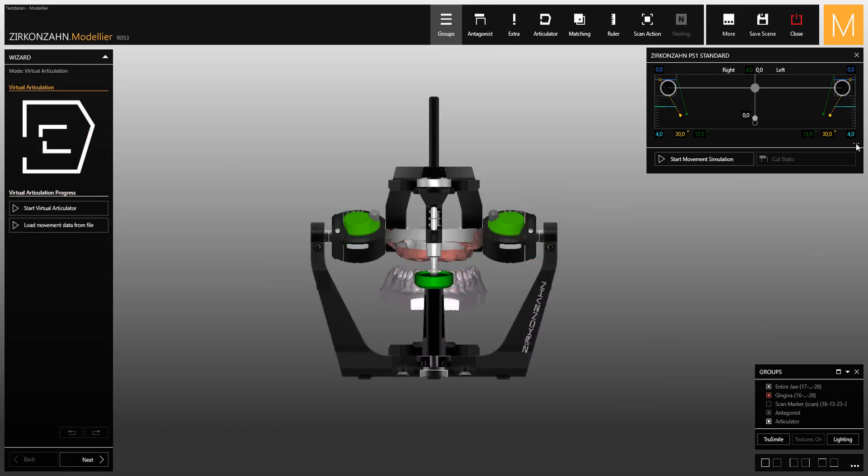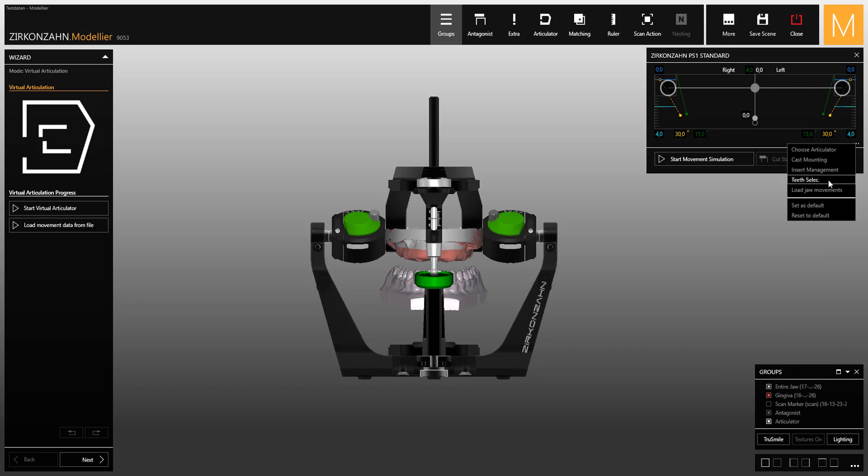The other new functions allow you to change the articulator and the position of the models, to select the teeth that you want to use in the model, and to load mandibular movements from the plane analyzer. All entered parameters can be set as default.